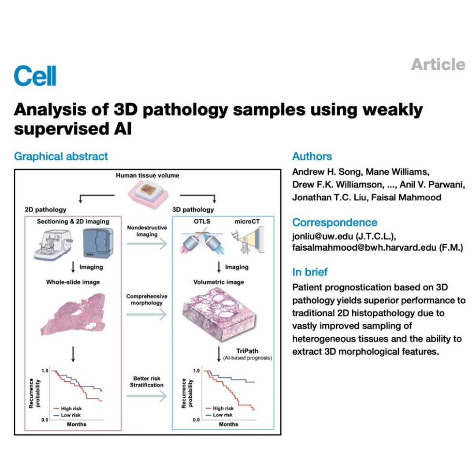Whoa. So the AI, looking at just the pre-surgery biopsy in 3D, was significantly better at predicting recurrence than the final grade given after looking at the entire removed prostate. That's what the data showed. A nearly 10-point AUC improvement using much less tissue taken earlier. It's pretty remarkable. That is remarkable.